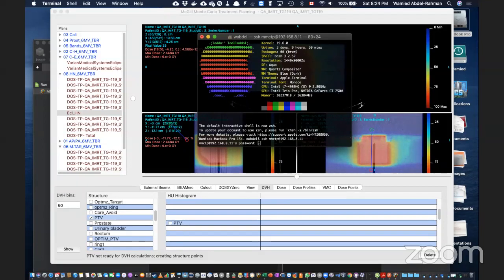Other ways are, for example, suppose we track a history. When I say history, it's known to everyone. So we have the history of a particle, and we know where it deposits dose. Imagine we can just repeat that exact history, or the doses it has deposited, in let's say 100 different locations, or we make 100 different tracks.